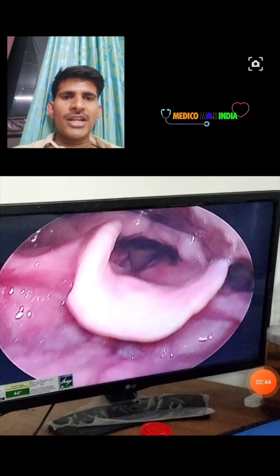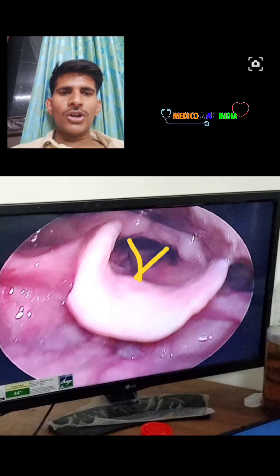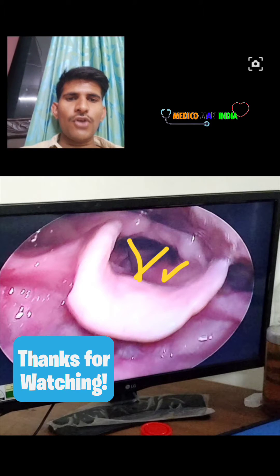Here you can see there are two whitish-colored vocal cords. There are two vocal cords, and here is the false vocal cord.